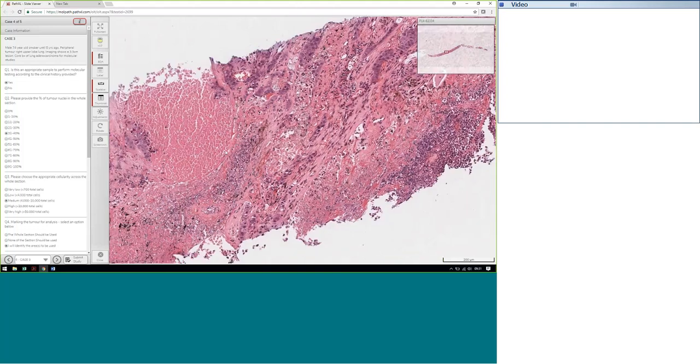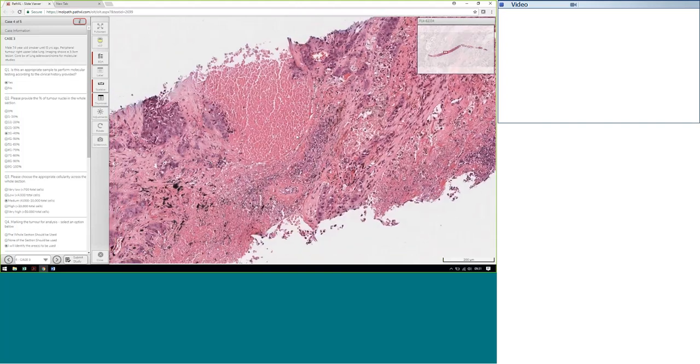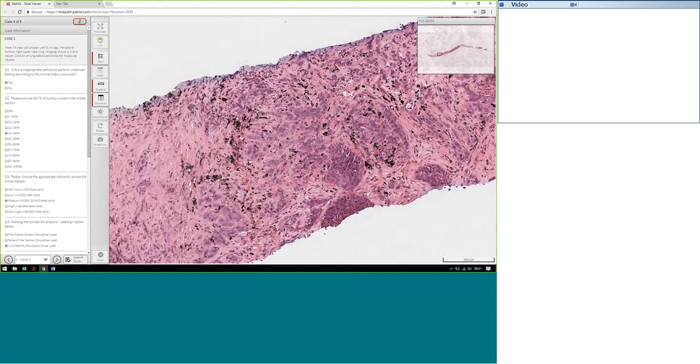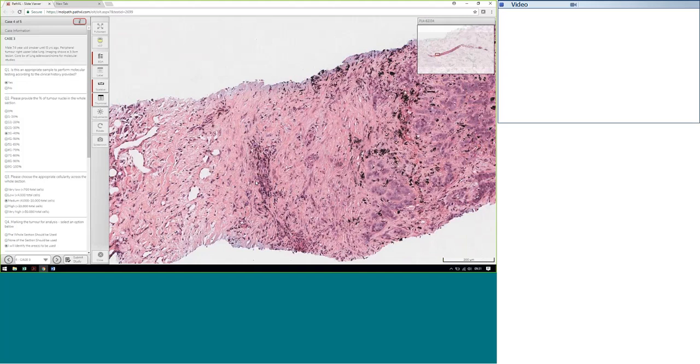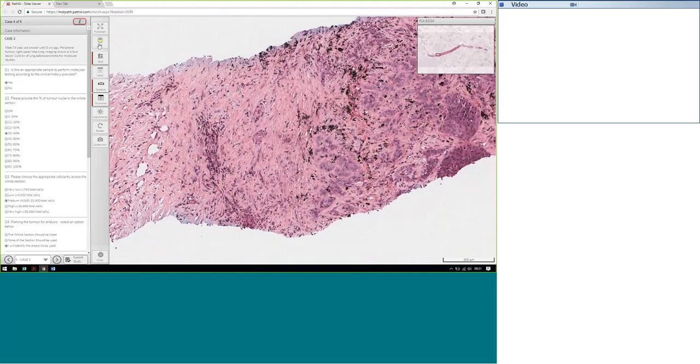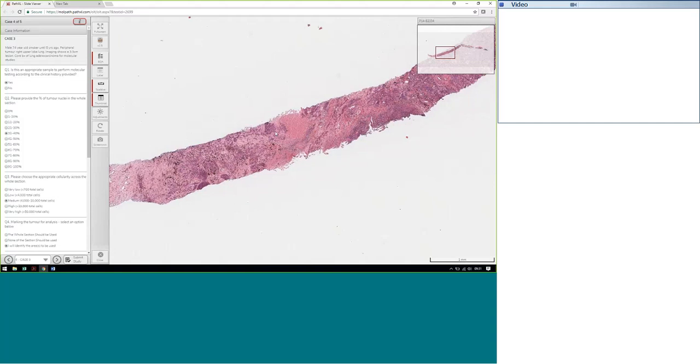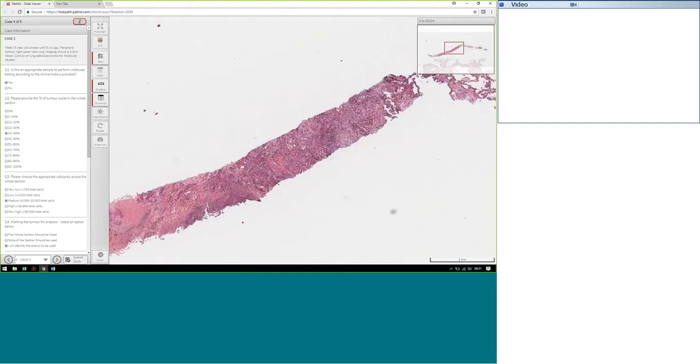So the expert panel decided that it was approximately 1 to 20%, the same issues as last time, defining whether it was 1 to 10 or 10 to 20, because of the dispersion of the tumour cells throughout. There's also a little bit of necrosis which needs to be taken into account, but as it's in the middle of the core, that would be difficult to remove. Anything to add to that, Perry?